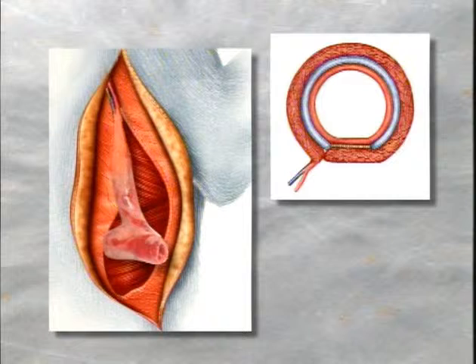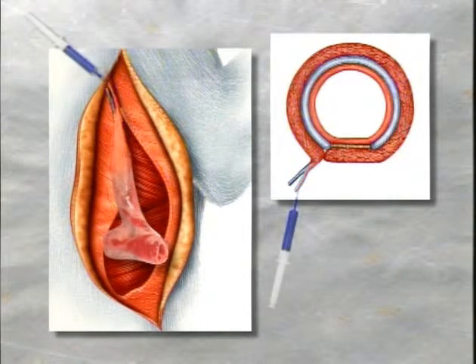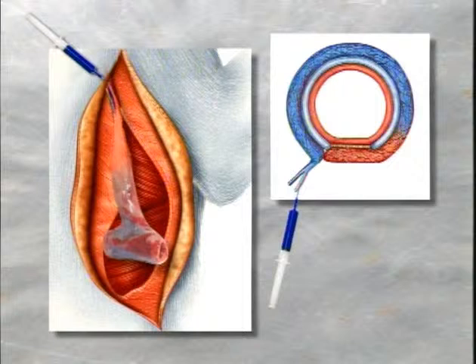To evaluate the areas perfused by the fascia flap after follow-up, the lateral thoracic artery of the fascia flap is injected with blue silicone dye. This material forms a cast of the vascular architecture of the fascia flap and the established vascular connections with the tracheal allograft.